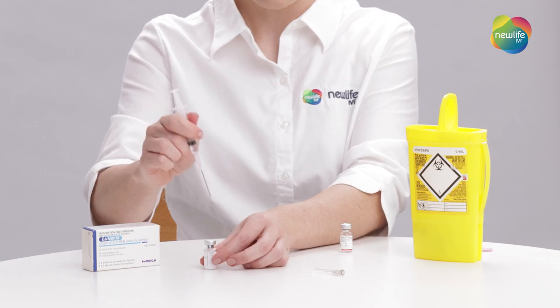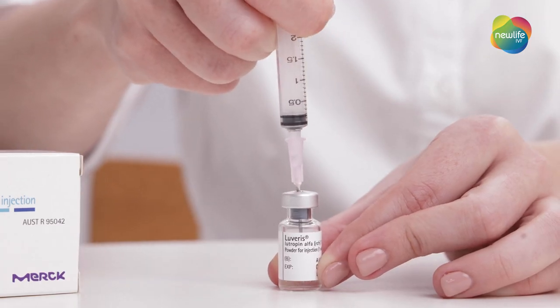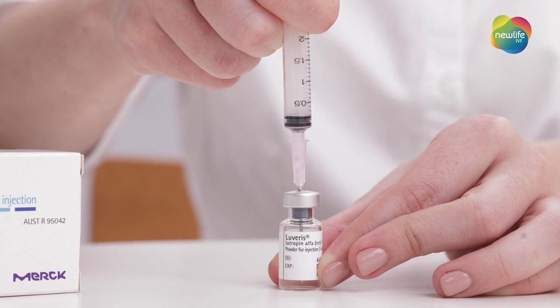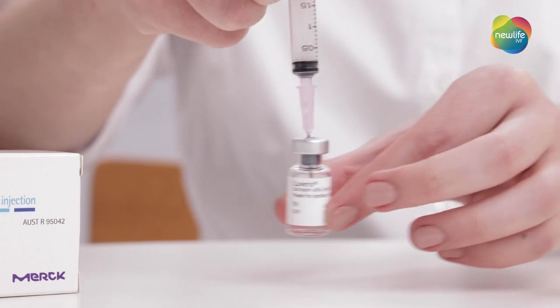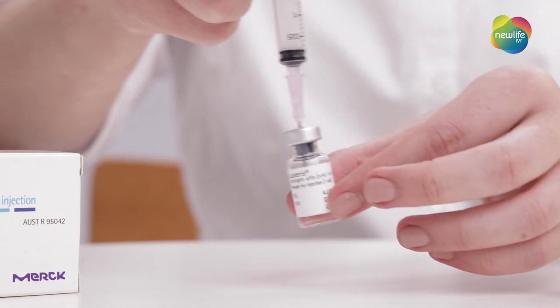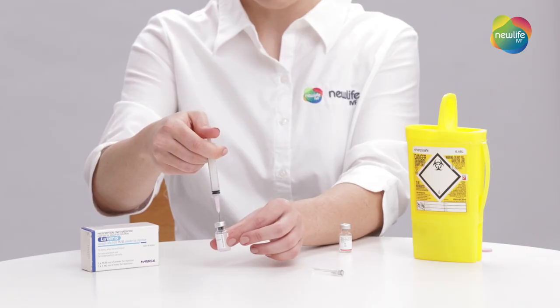Put the syringe with the needle attached into the Levaris powder vial, pushing the water in. The powder will instantly dissolve. However, if you do notice any undissolved specks of powder, you can gently swirl your solution until completely dissolved. Do not shake it.